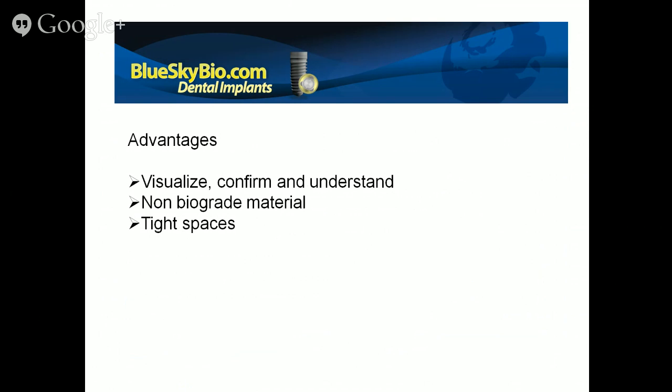Why is that important? It's important because 3D printers that print biograde material are significantly more expensive. That's the situation for now. It could be that in coming time we expect that the prices will go down, the material costs will go down, and then there wouldn't be much of a difference between using this technique and the other technique.